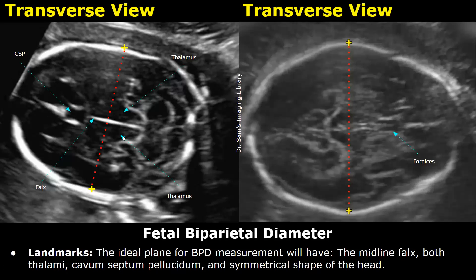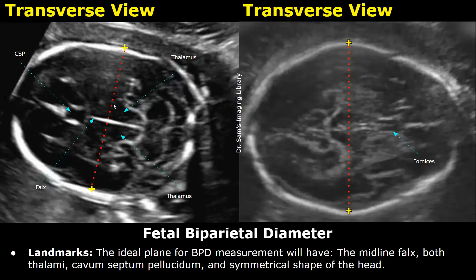This level is ideal for measuring BPD. Some BPD measurements can be taken at a slightly different level where you see the fornices instead of the cavum septum pellucidum. This is also acceptable to measure the BPD, but the first level is ideal.